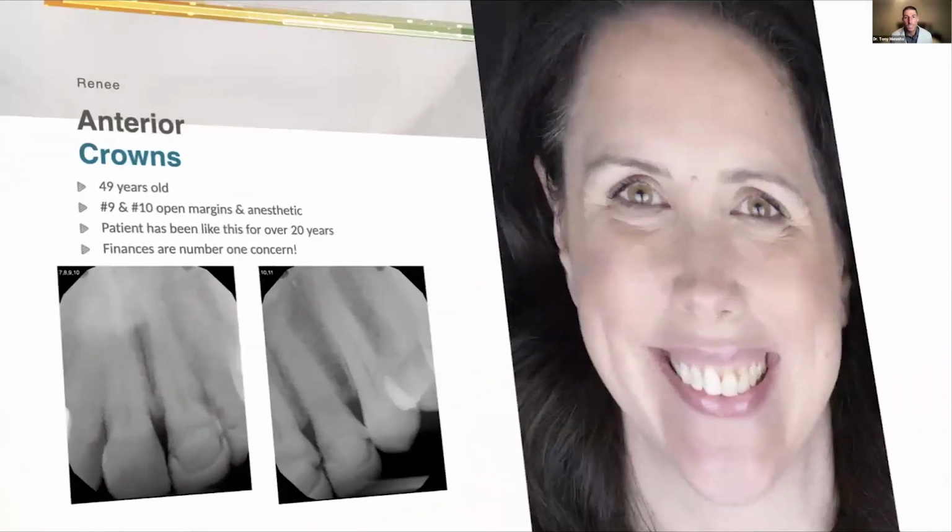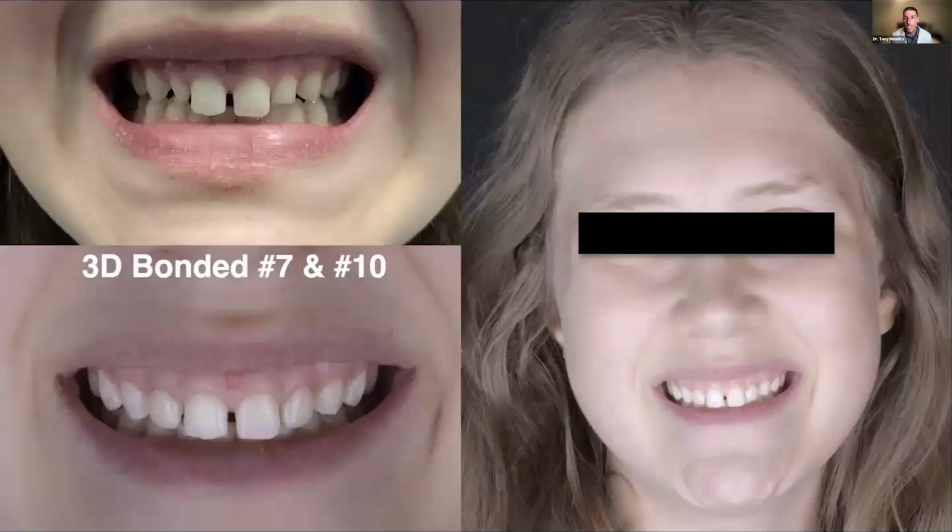Meredith, this is brilliant because a lot of, especially younger dentists, don't understand that orthodontists don't know where teeth should go. Like they were taught to close spaces, right? So if they're ever asked to leave spaces, or if they have teeth that are not the ideal size, it is so helpful for us to make the teeth the right size before ortho. That really helps them to visualize where the proper position of those teeth should be. So this is honestly next level stuff, because once again, this is your patient, right? And if you don't guide the orthodontist, you're probably not going to get the result that you want.